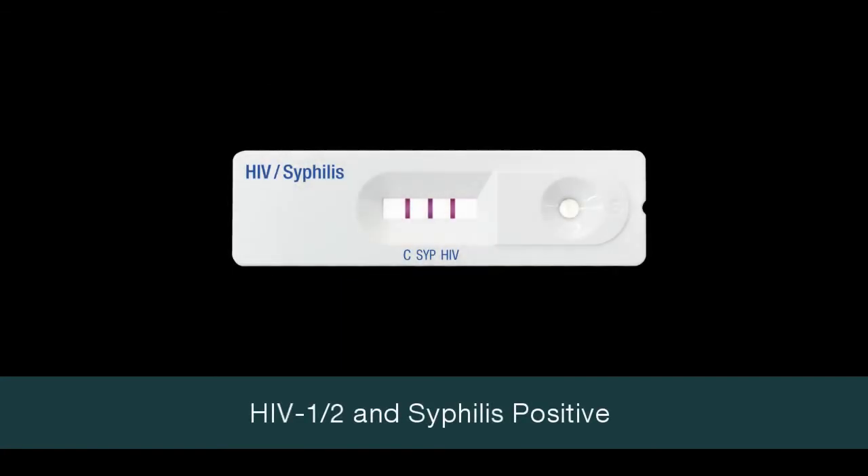Three lines — control line C, test line HIV, and test line S-SYP — within the result window indicates a positive result for both HIV 1 or 2 and syphilis.